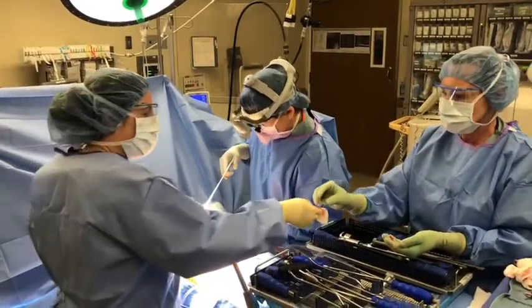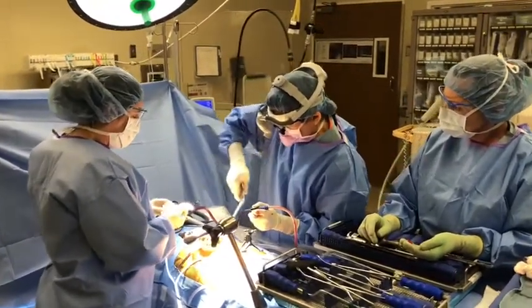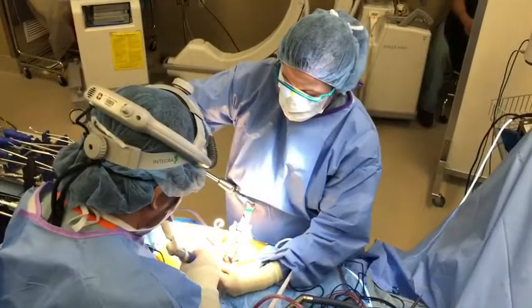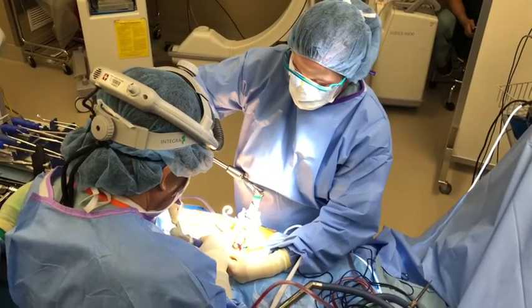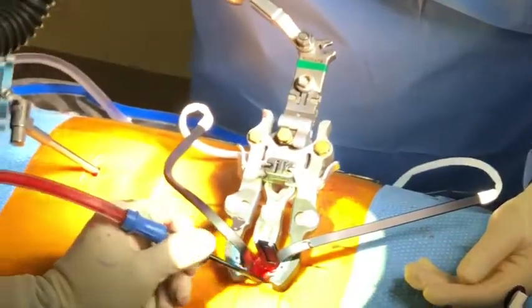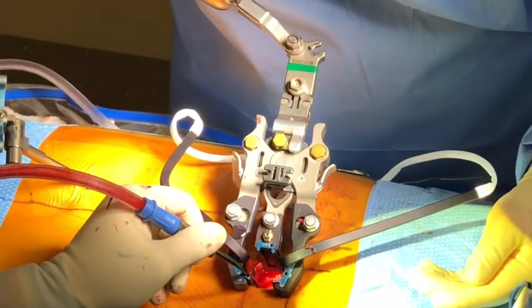I am now at the L1 vertebral body and I'm removing all the broken pieces of bone. You can see all the broken bone being removed.